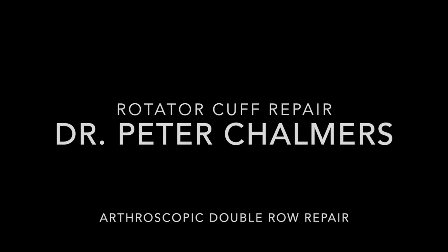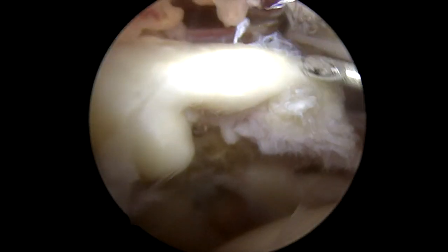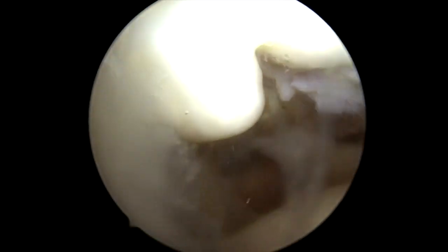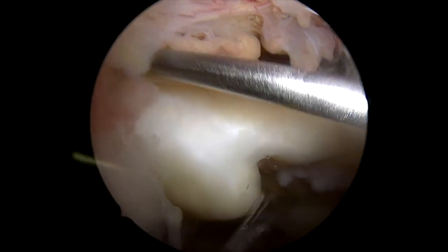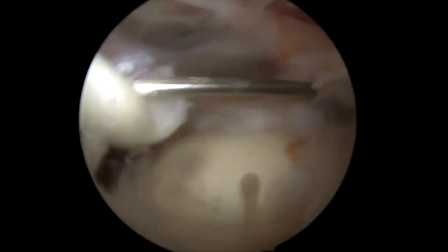What you're going to see here is arthroscopic video. We're looking from the back of the shoulder — you can see towards the front and towards the inside of the shoulder. Here, that's the torn edge of the tendon that I'm manipulating with this spinal needle.